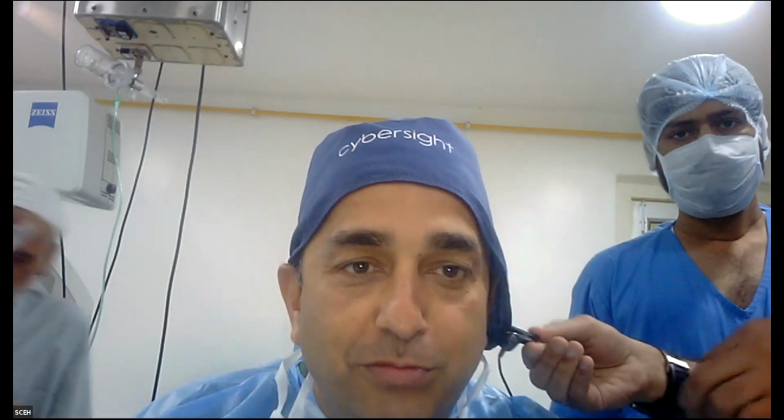Okay, so we have a question from Dr. Raghav Preetham. Can you elaborate about using longitudinal power, torsional, and intelligent phaco regarding when to use each one of them precisely? So longitudinal power is what you use conventionally in most machines. The torsional power is available only in a few machines like the Infinity or the Centurion. And I think some of the other companies have something similar to that.